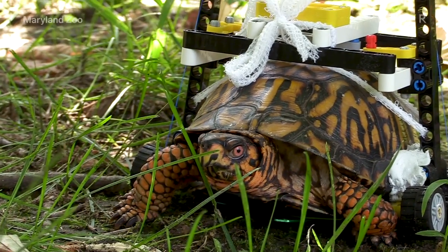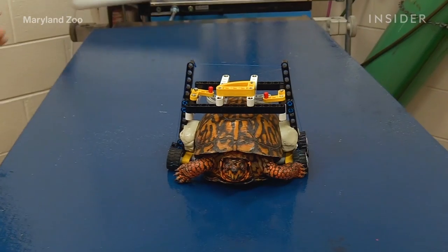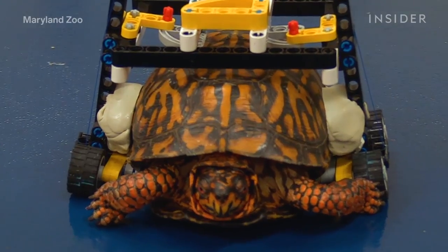She was actually willing to send some of her collection over to us from her own personal Lego collection, and so using that and some spare pieces we were able to modify it.